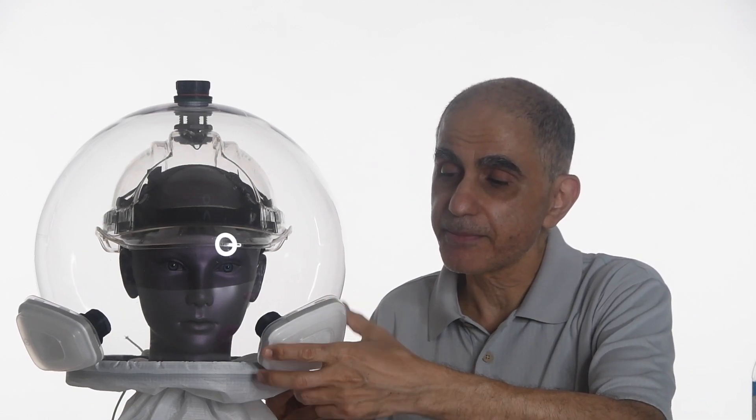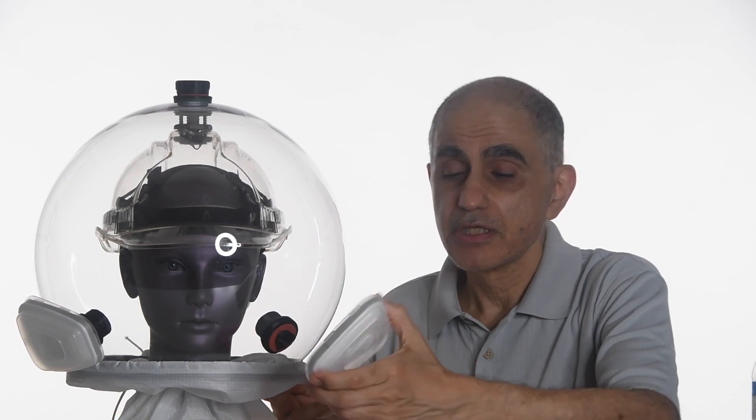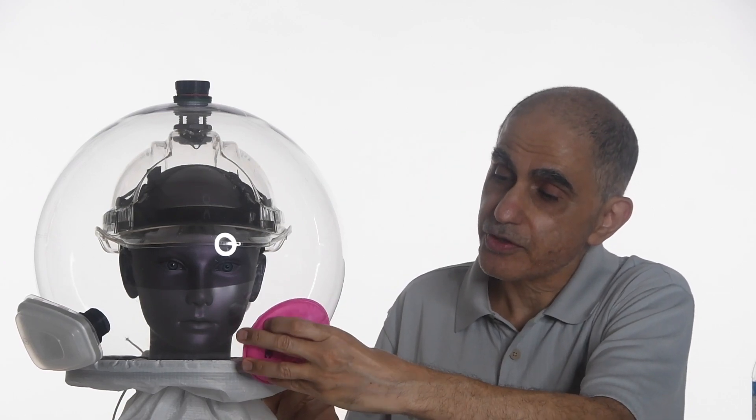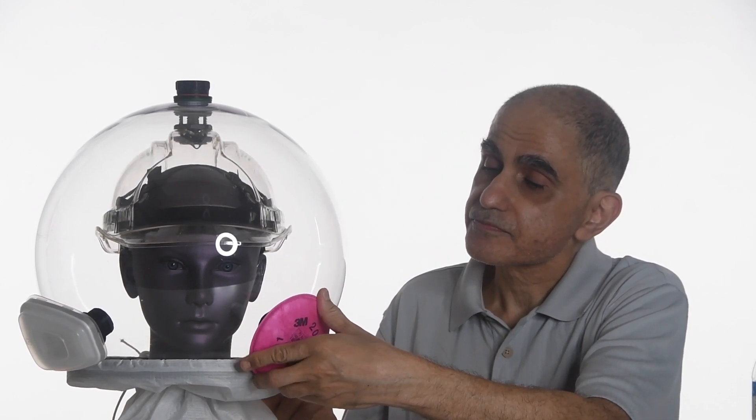The filters we use are standard N95 filters available from 3M and others. So for example, we use a bayonet mount, which is the 3M mount. You can take out this is an N95 filter that's readily available. You can replace it with a P100 filter if you want greater filtration, depending on your case.